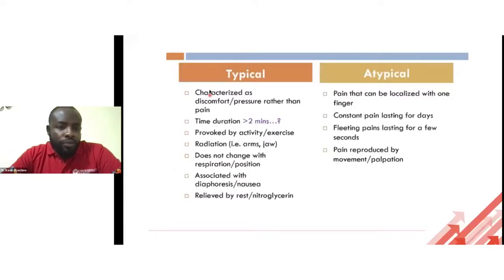That should point you towards ischemia or acute coronary syndrome, as opposed to atypical chest pain. Usually, most of the time, the majority of patients that present to our ED have a pain that the patient can actually point to you.